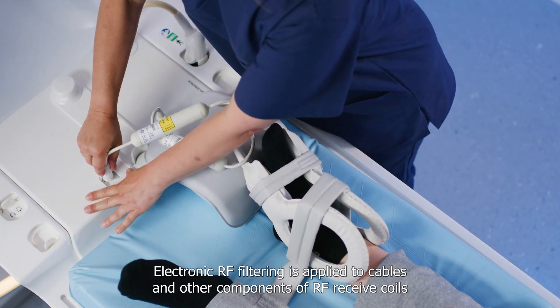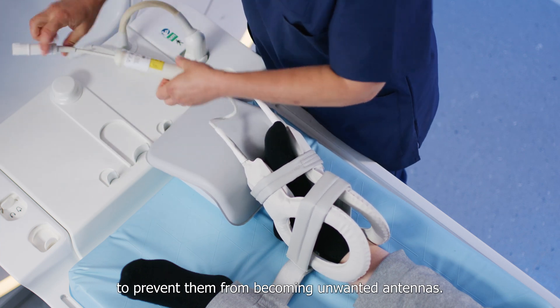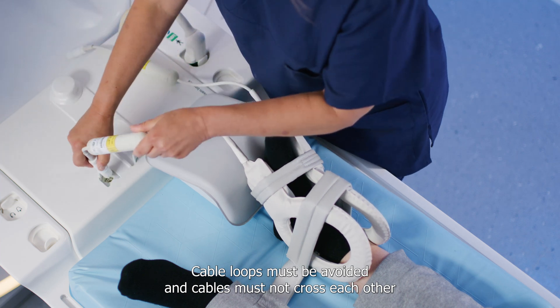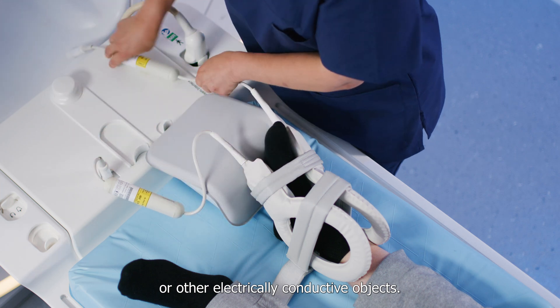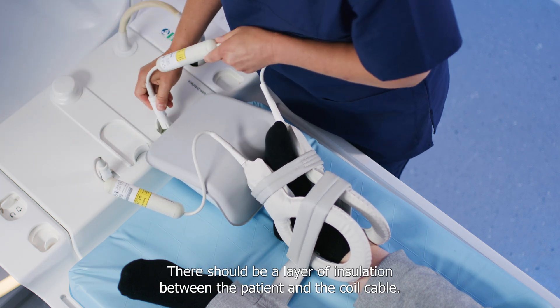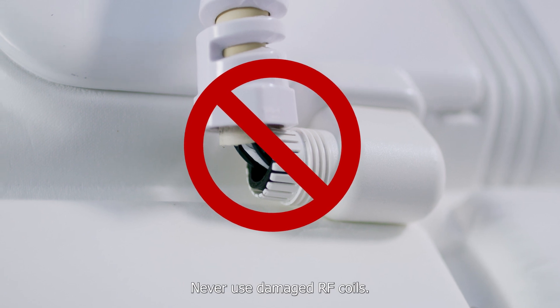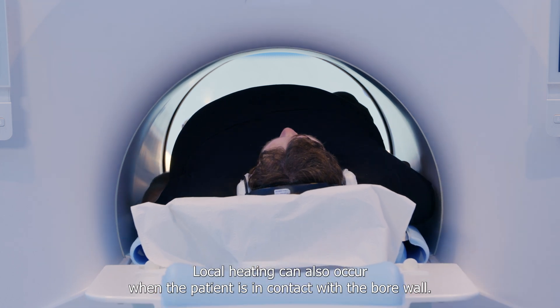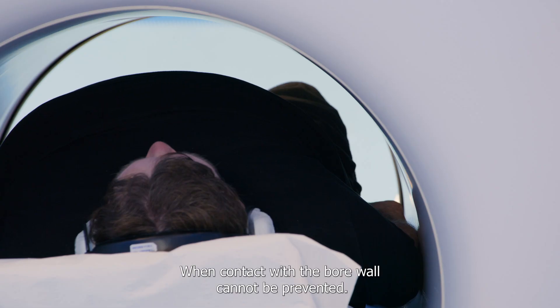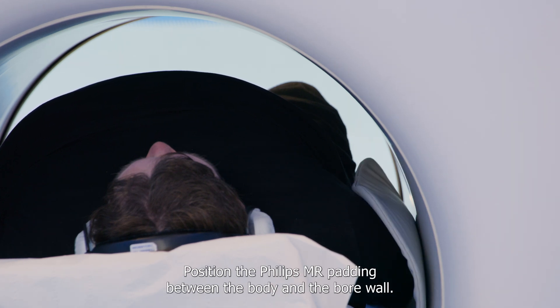Electronic RF filtering is applied to cables and other components of RF receive coils to prevent them from becoming unwanted antennas. Cable loops must be avoided, and cables must not cross each other or other electrically conductive objects. There should be a layer of insulation between the patient and the coil cable. Over time, RF coils are subject to wear and tear — never use damaged RF coils. Local heating can also occur when the patient is in contact with the bore wall. When contact with the bore wall cannot be prevented, position the Philips MR padding between the body and the bore wall.